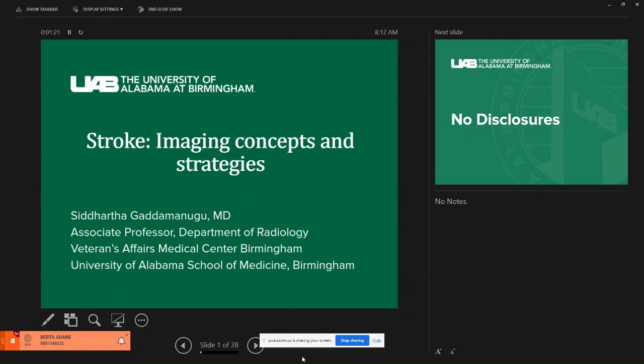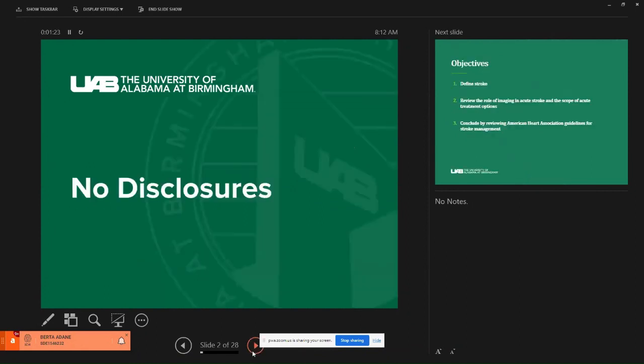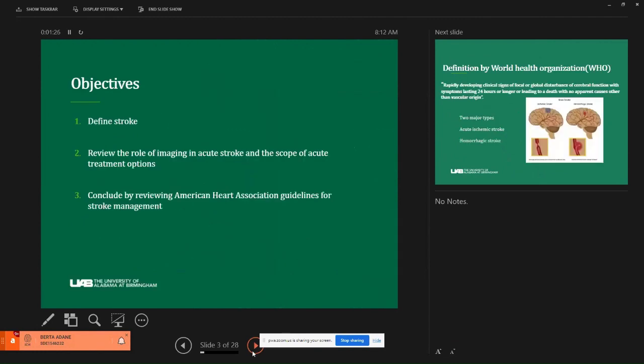I have no disclosures. The objectives of this presentation are to define a stroke, the role of imaging in acute stroke, and the treatment options. We will conclude by reviewing the American Heart Association guidelines for stroke management. We will only talk about acute stroke imaging in our presentation today.